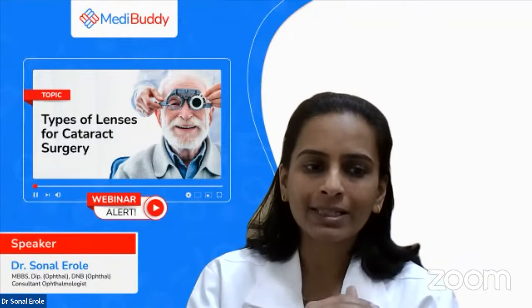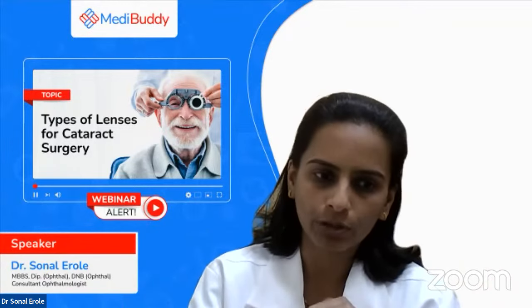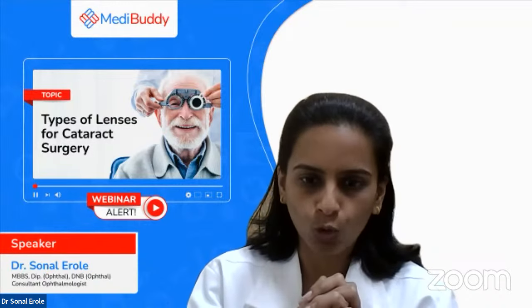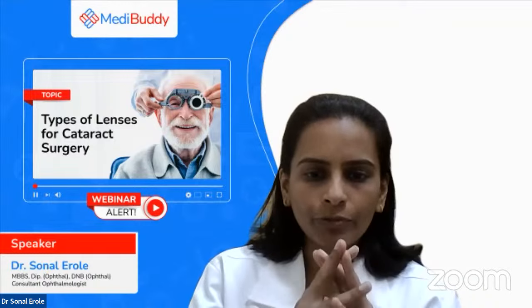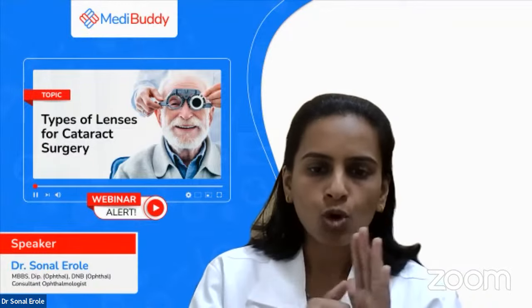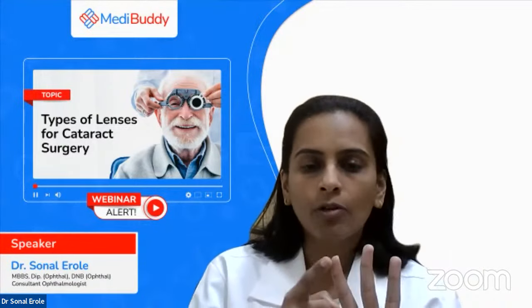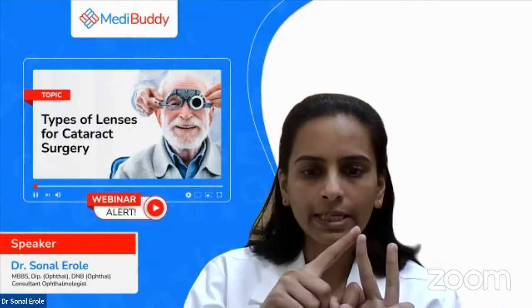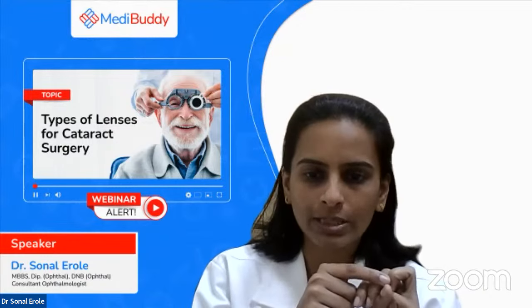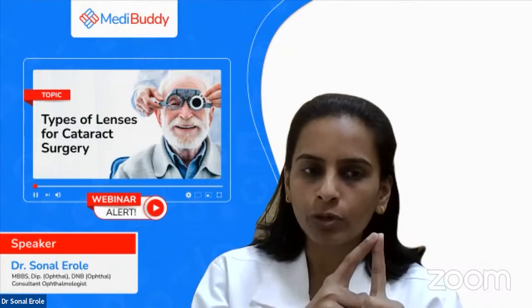Now, with all these advances, there are multiple choices of IOLs for the patients, and patients get confused about which IOL to go for. So first I will give you insight into what types of IOL we have. On a broad spectrum, we have three types of IOLs. One is the monofocal IOL, second is the multifocal IOL, and third is the extended depth of focus IOL, which is the newest concept of all. First I will go with the monofocal IOL.